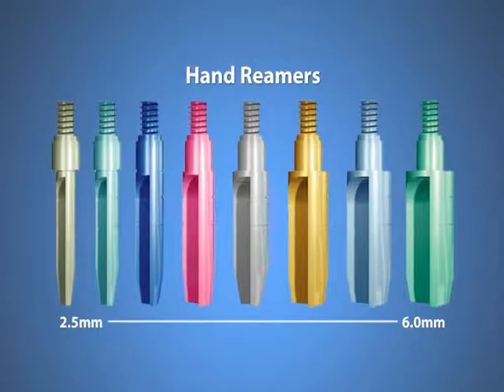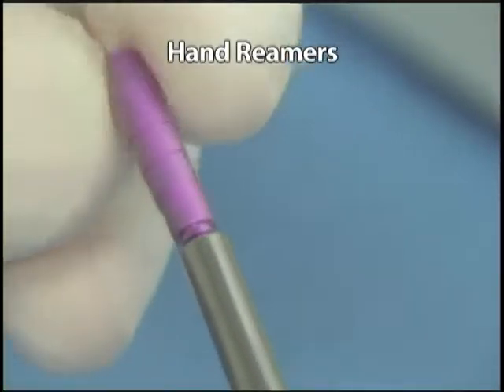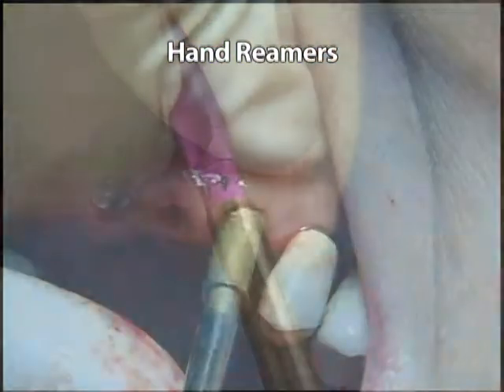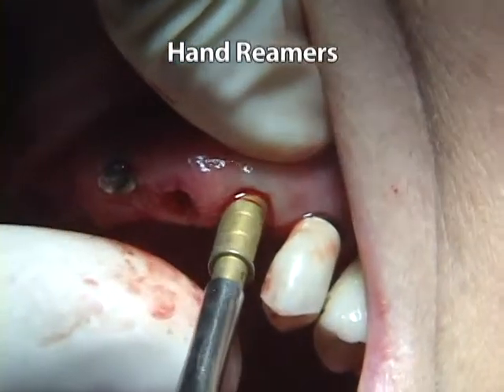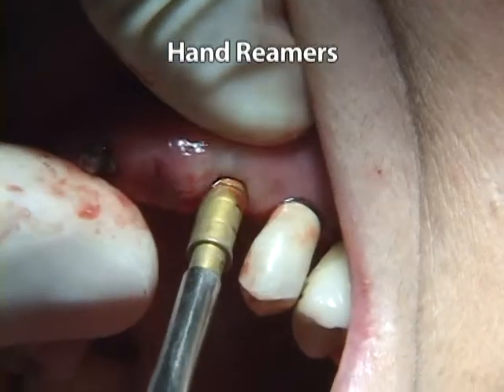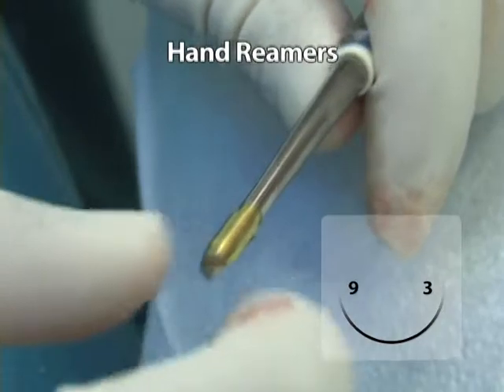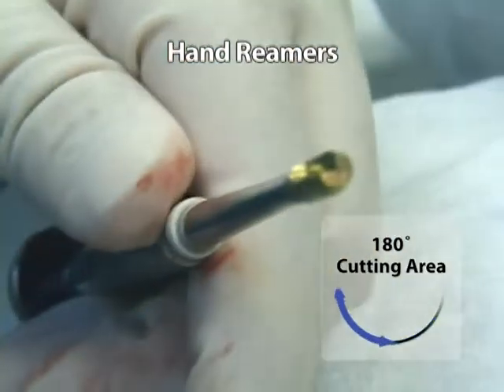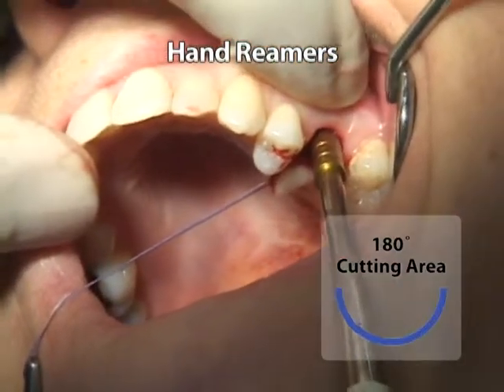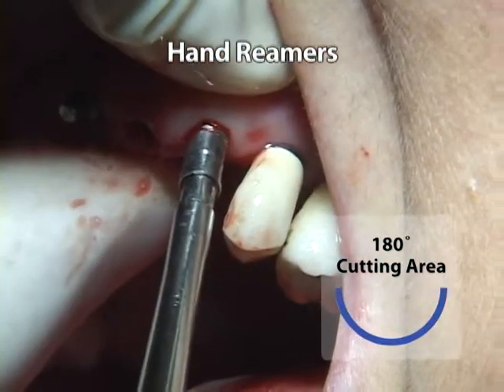Alternatively, hand reamers threaded on a straight handle may be used to widen maxillary pilot osteotomies. Their use facilitates a clinician's perception of the harder cortical layers of bone around the osteotomy, as well as the movement of the thin walls of an osteotomy. Therefore, the use of hand reamers enhances the clinician's ability to avoid inadvertently penetrating the nasal floor, the maxillary sinus, or the walls of an osteotomy.